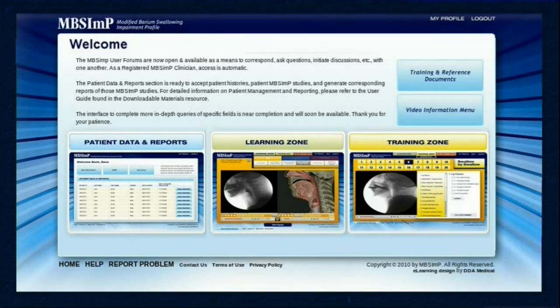Collect data that can assist profiling variations of swallowing impairment in terms of presentation and recovery patterns across like diagnostic categories. Demonstrate evidence for targeted treatment.